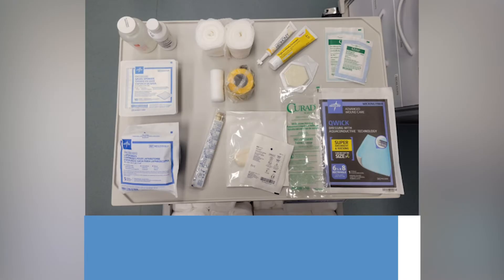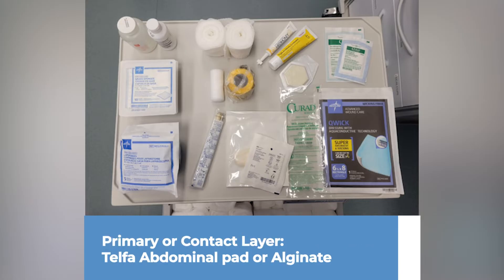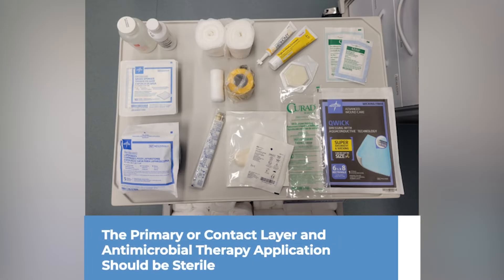The first layer of a modified Robert Jones bandage is the primary or contact layer. The primary contact layer usually consists of a telpha abdominal pad or even alginate. At this stage in the bandage, topical antimicrobial therapy can be applied, and this can be as simple as honey or triple antibiotic ointment. These antimicrobial therapies should be applied sterilely.